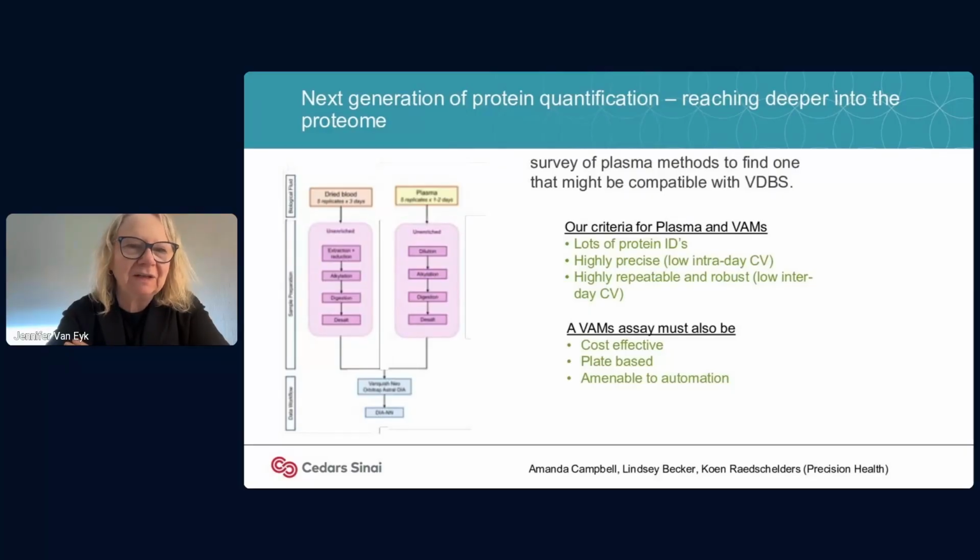So what we wanted to do with the dried blood is use the same concept of nanoparticles, but because we'd have so many more samples, since you're now not doing a single blood draw but multiple blood draws, we needed to find something cost effective. So we started to look around for other nanoparticles. I'm going to talk about a company, Ceres, that has a set of nanoparticles that we're in collaboration with, and this will actually be the first time we're speaking publicly about it.